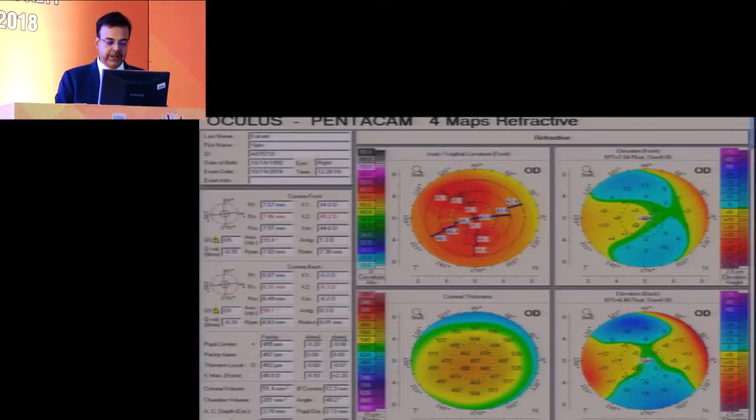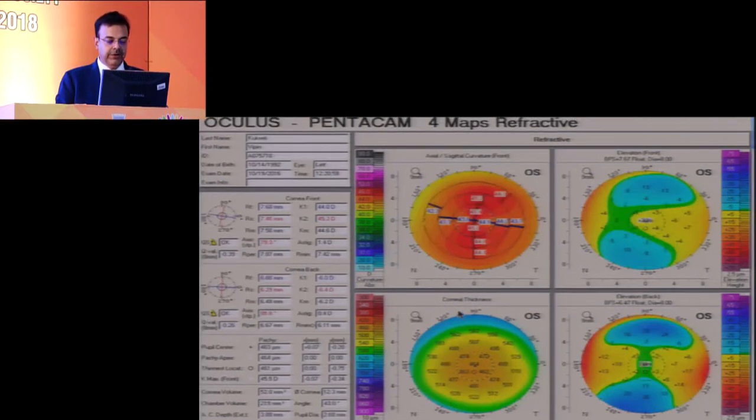This is what the pentacam maps look like. If you'll notice there is a skew in the axis which is a bit of a flag, and if you'll see the elevation maps, the pachymetry is small—it's about 460. If you'll notice the other eye, that is 464, similar skew.